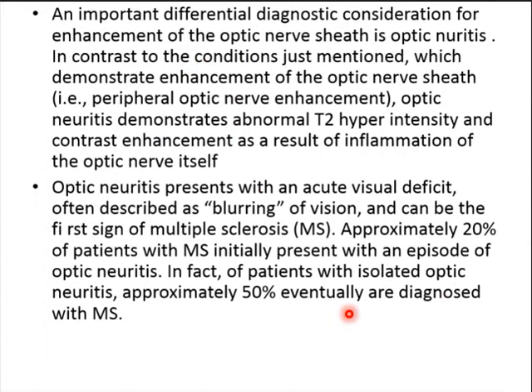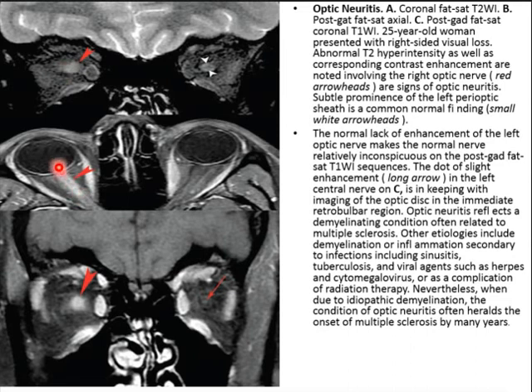An important differential for enhancement of the optic nerve sheath is optic neuritis, which demonstrates enhancement of the optic nerve sheath and hyperintensity and contrast enhancement of the optic nerve itself due to inflammation. It may cause acute visual deficit described as blurring of vision and can be the first sign of MS: about 20% of patients with MS initially present with optic neuritis, and up to 50% of patients with isolated optic neuritis will eventually be diagnosed with MS. In this case, the optic nerve is inflamed, swollen, and edematous compared to the contralateral normal optic nerve, suggesting optic neuritis. We should look carefully for other signs of multiple sclerosis.